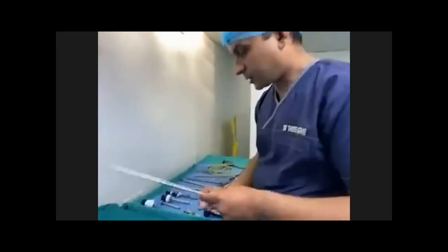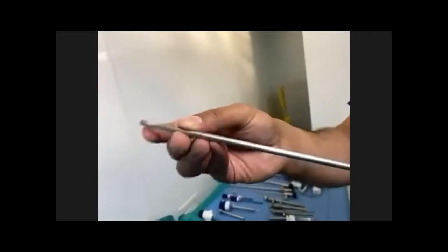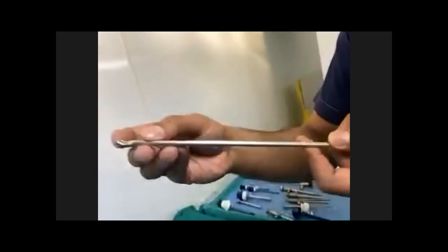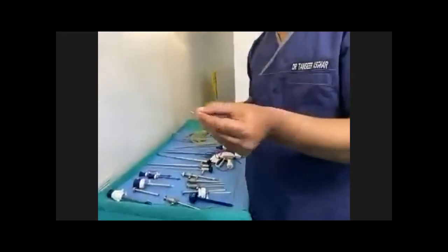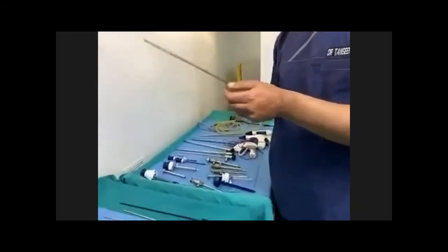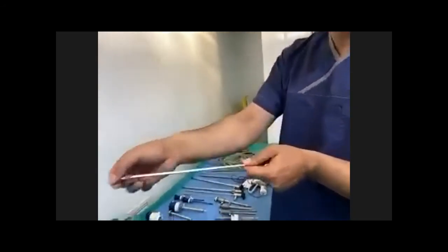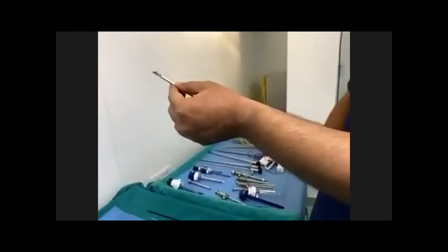This is a very important instrument. This is called the knot pusher, right? You see, there is a hole inside it. Usually the extracorporeal knots which are tied and put inside, for example, if you are tying the base of the appendix, right? You put in the extracorporeal knot and pass it through it. And then when you push it, the knot will go in. So it is the knot pusher.